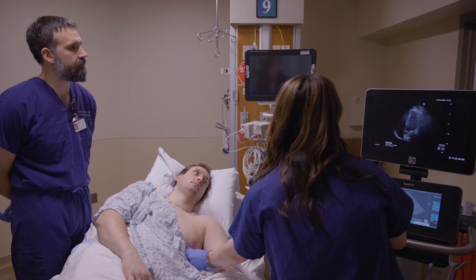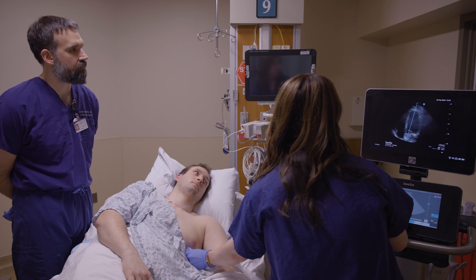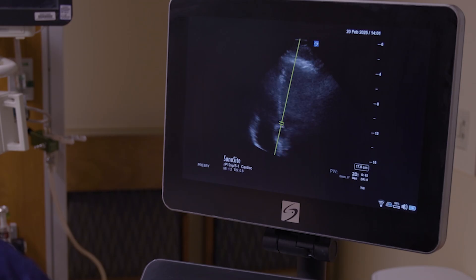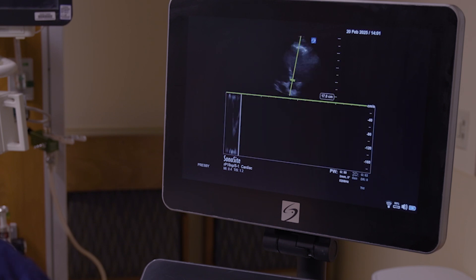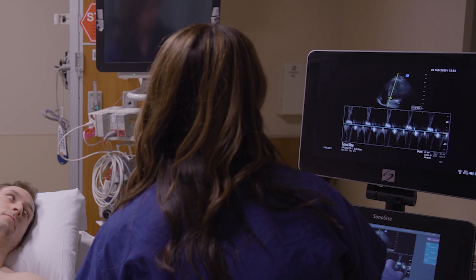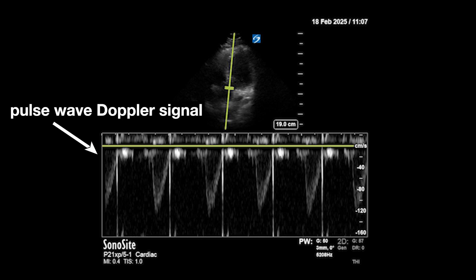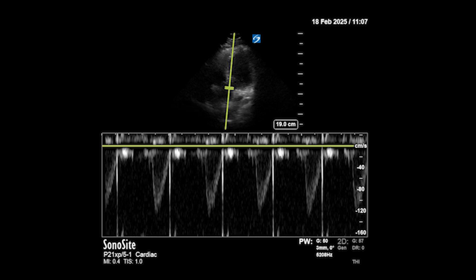Now Lauren is going to do pulse wave Doppler, placing the gate just proximal to the aortic valve. Notice that she's aligning the Doppler angle with the angle of blood flow. Lauren now has a nice tracing of pulse wave Doppler signal. The y-axis represents the speed of blood flow right at that gate — that is the speed of blood flow going through the LVOT.